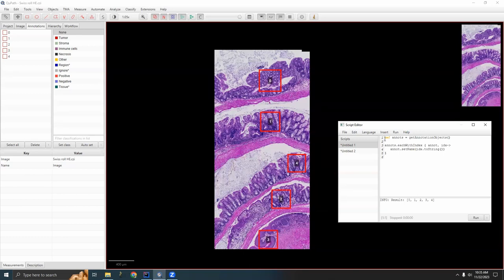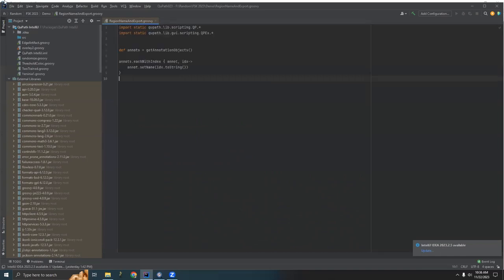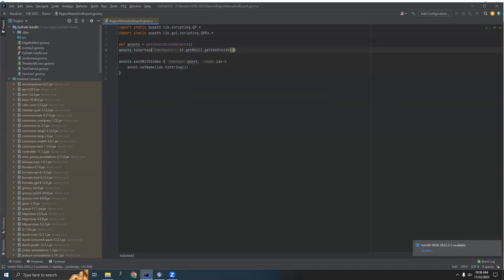And from here, I'm actually going to move into IntelliJ to make sure I don't make any mistakes. So I'm going to just insert the import statements here and then copy this into IntelliJ. Here's my nicely prepared blank file. So I want to sort from top to bottom, which means by the y coordinate. And so I'm going to use the toSorted function, annots.toSorted. And then the way this works is it sorts this list based on whichever measurement I'm about to give it. And in this case, to call the y coordinate, it's it.getROI().getCentroidY(). You can replace this with, obviously, centroid x would be better in some cases, or maybe area or anything else you could think of, whatever makes sense for your project.